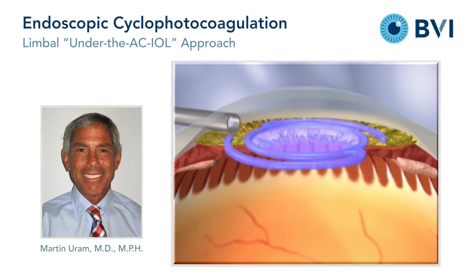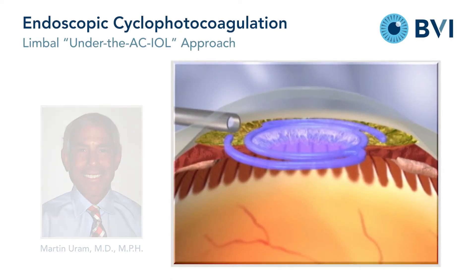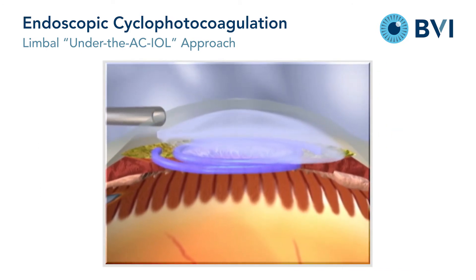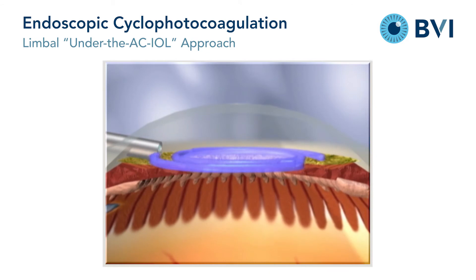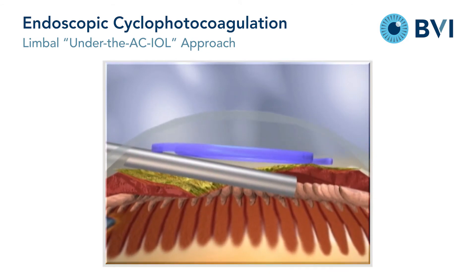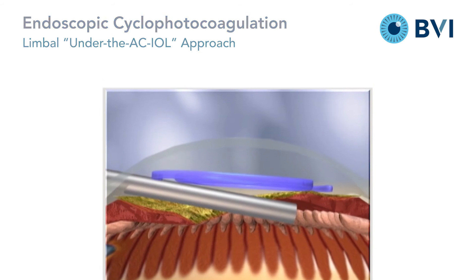In the anterior chamber pseudophacic eye when approached from the limbus, viscoelastic may be helpful when placed over the anterior surface of the lens to protect the corneal endothelium. The laser endoscope is placed through the limbal incision beneath the lens implant and under the iris to access the processes.